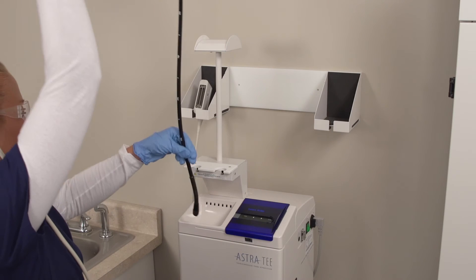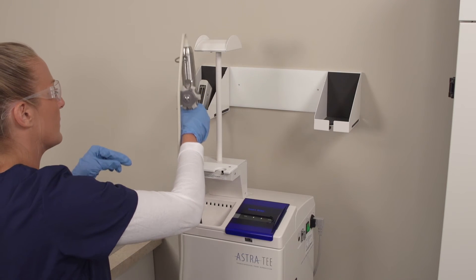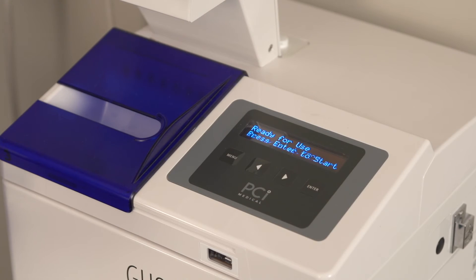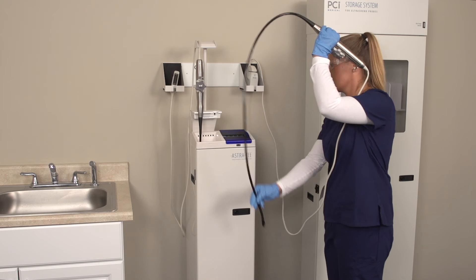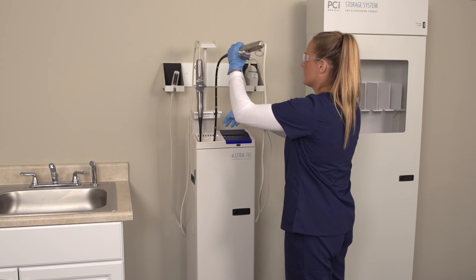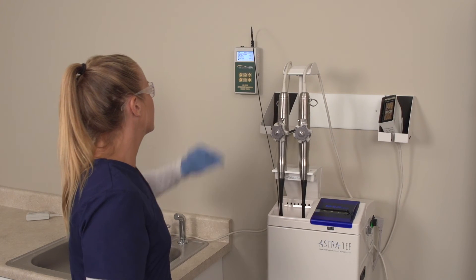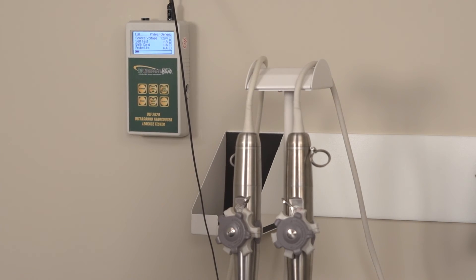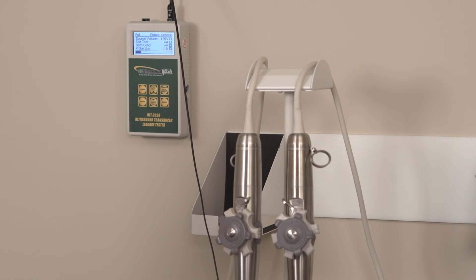Astra is the only automated disinfection system that allows you to disinfect one or two probes at a time. Disinfecting two probes improves your turnaround time and reduces cycle costs — one Astra can take the place of two other automated systems. With Astra, you can perform an electrical leak test right inside the machine. A leak tester is available as part of our complete line of high-level disinfection products.